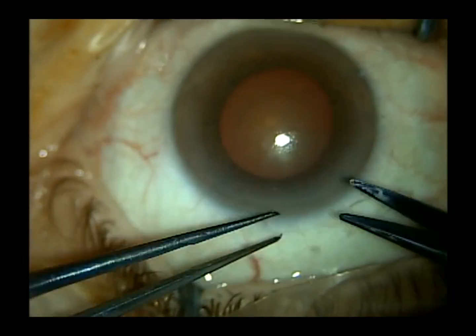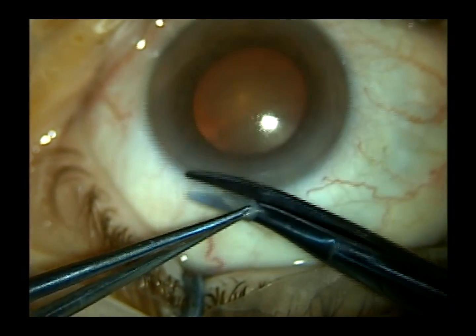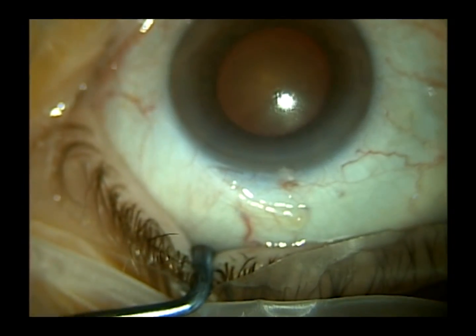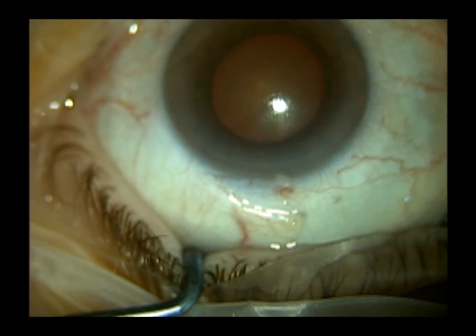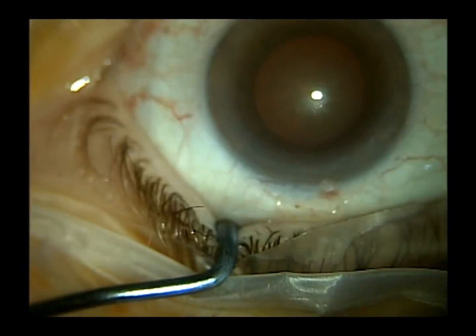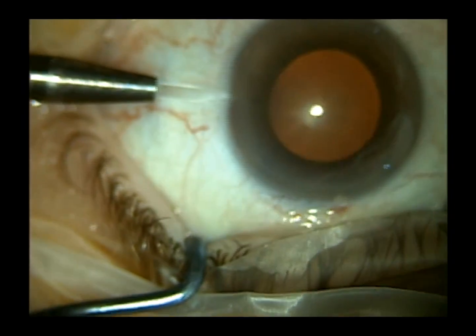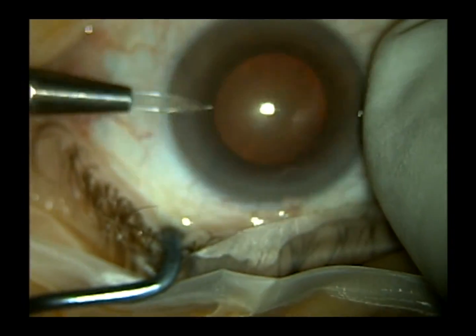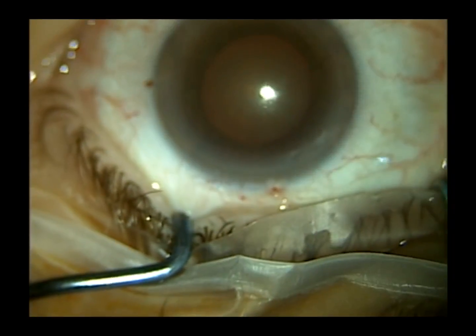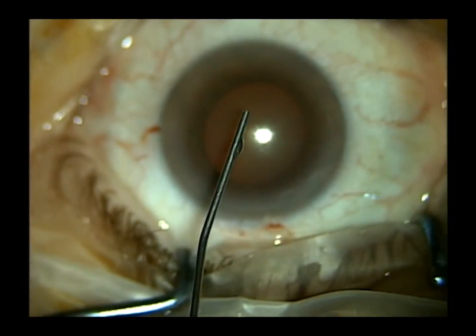This is a case of cataract surgery in the presence of a small myotic pupil. It's just a routine cataract case. This patient happens to have some astigmatism at axis 90 degrees, so I go ahead and operate on the steep corneal axis to reduce this patient's astigmatism while also correcting their cataract.